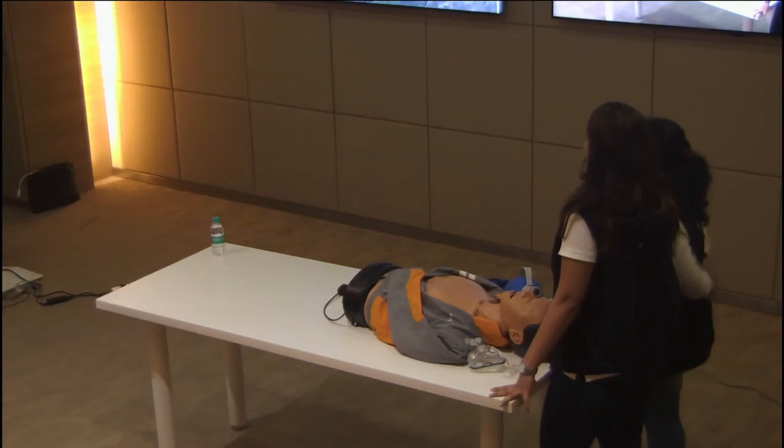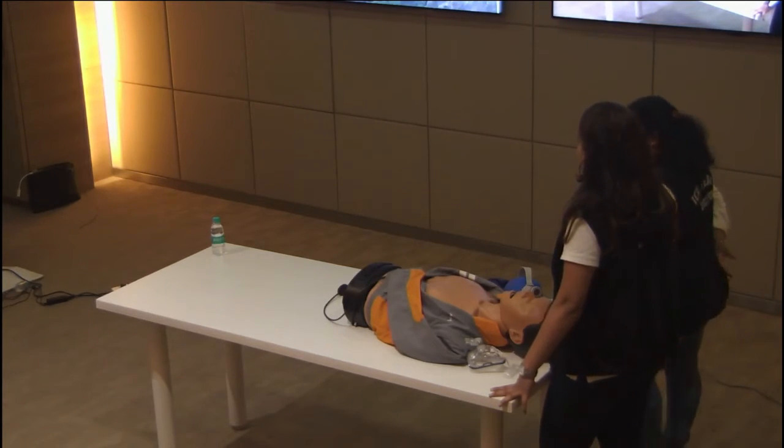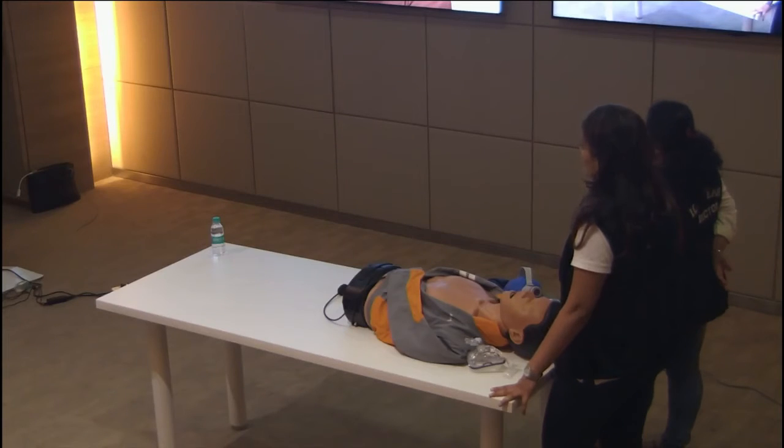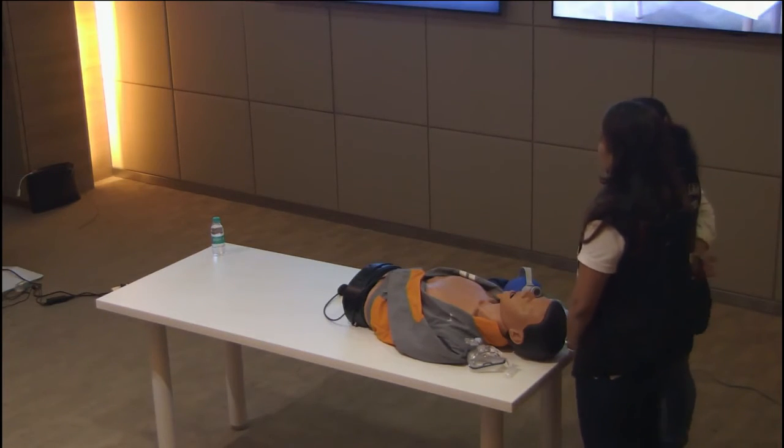So what we are trying to do is increase this apnea time. We want to increase this apnea time. So let's recap it. It takes 23 seconds for a critically ill patient to desaturate. Hardly 23 seconds. So what is the high FiO2 source that we'd like to give? We possibly want to give the highest FiO2 source, and for that you have the NRBM. Yes, no doubt about it. The NRBM is a high FiO2 source.